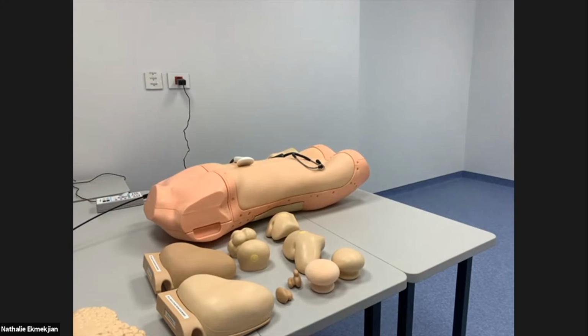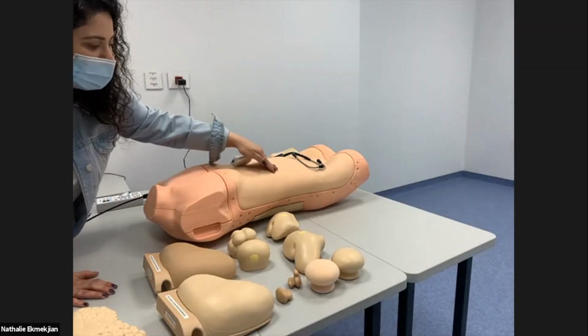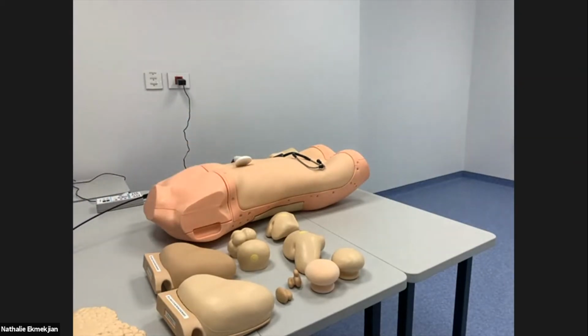And when we press on the foot paddle, we can feel the inspiration and now the expiration. So here we can palpate the liver. So now expiration.